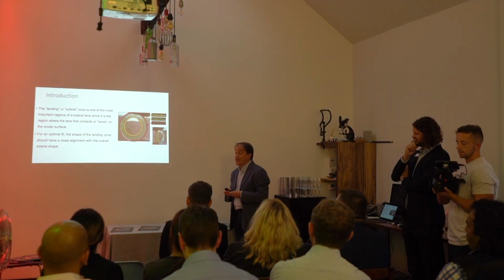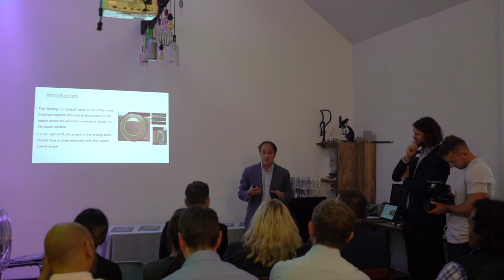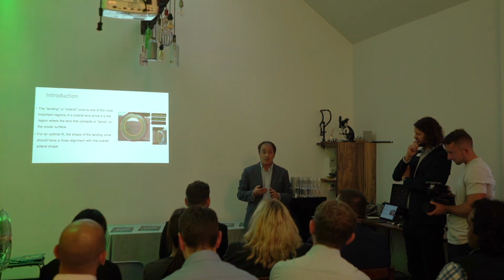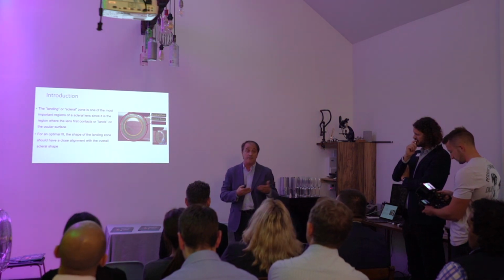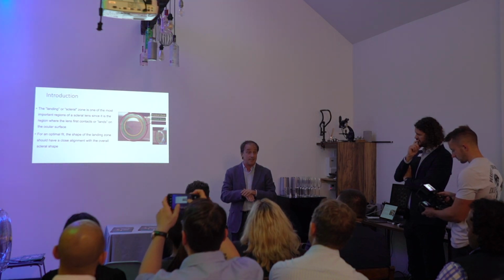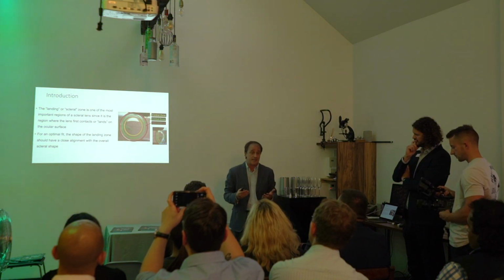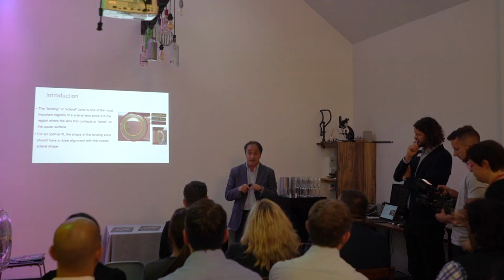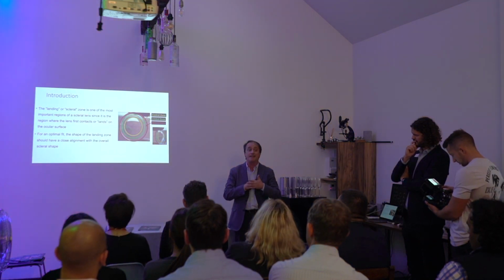So, as you know, fitting scleral lenses seems simple, but it's not simple, because it's important to understand some relationships, and some relationships are not so clear. If we fit corneal lenses, we have a topographer that supports us to find the best relationship between the lens and the cornea. But using scleral lenses, the most important thing is the relationship between the peripheral part of the lens on the sclera, and to evaluate which is the interaction.